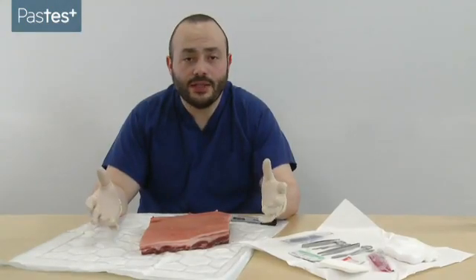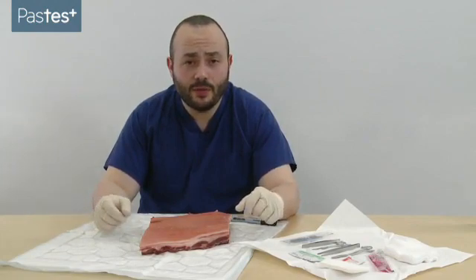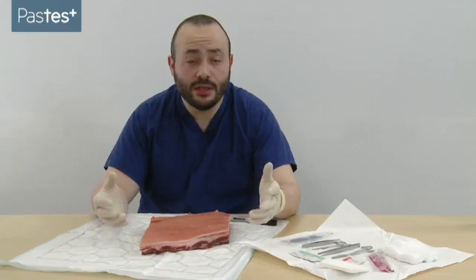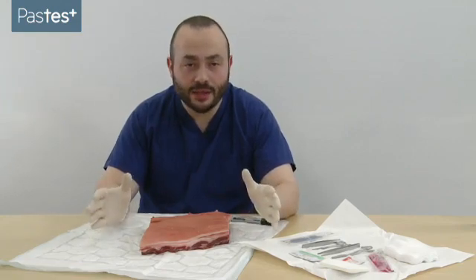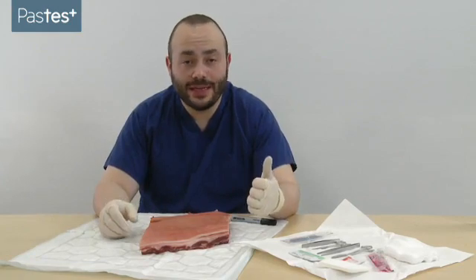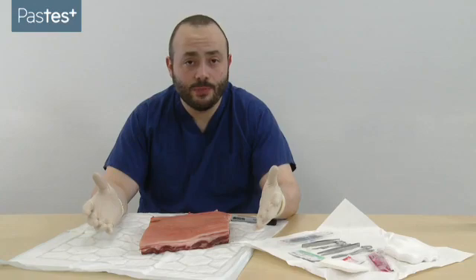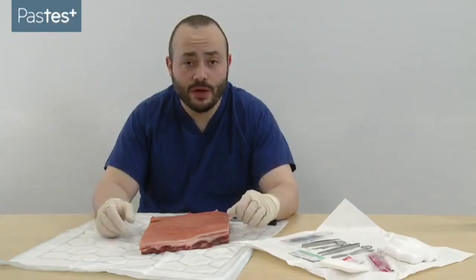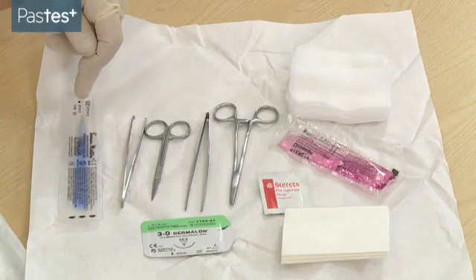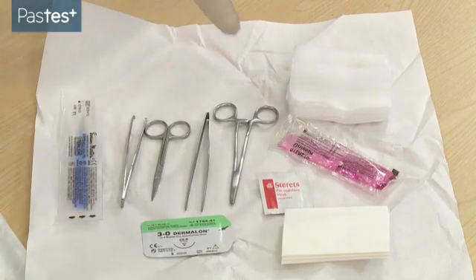Today's video is going to talk about the excision of a cutaneous lesion. This has come up a couple of times in the exam, so you need to be confident at it to achieve it in the time allotted. The first thing to do is treat this like any other surgical procedure — make sure you've checked your patient, both their identity and their consent form, like any WHO checklist. You then need to make sure you've got all the equipment you need: a scalpel, equipment for suturing, and skin prep.